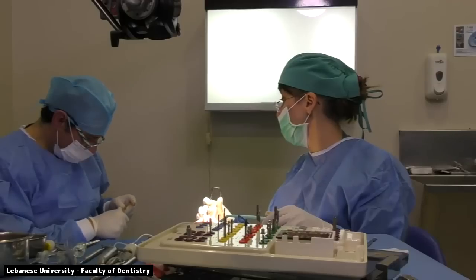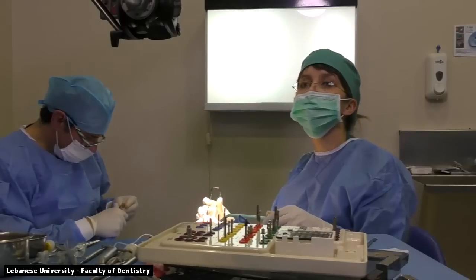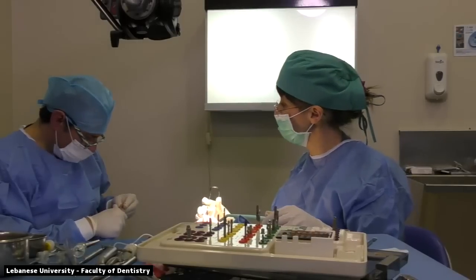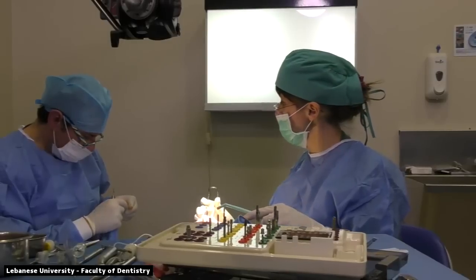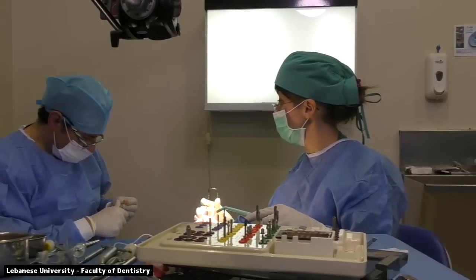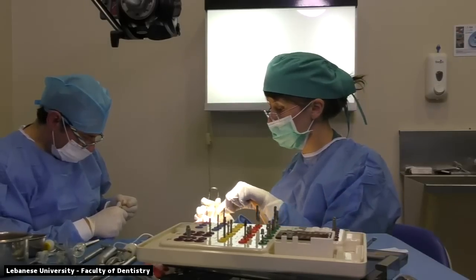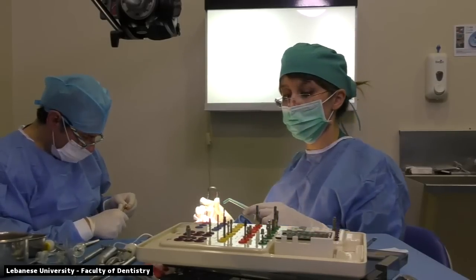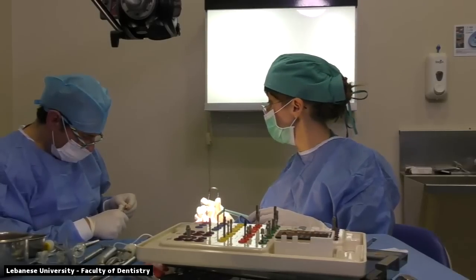And this will create a hygienic temporary that will be placed on the two tissue level implants that were just placed, and the two abutments that were attached to the tissue level implants. As you see, adjustment of the temporary restoration takes time, so it's crucial that we have a shell of a temporary restoration done prior to our surgery.